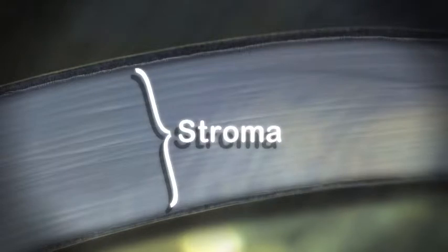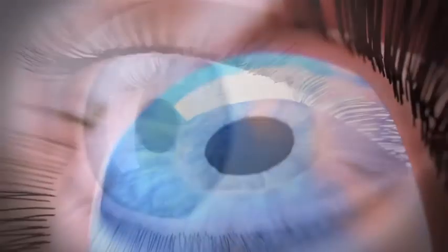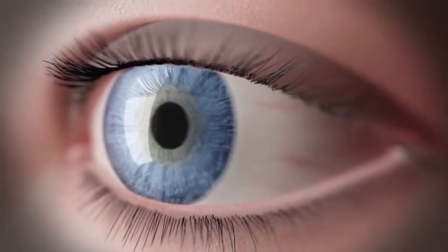This next layer of cornea is called stroma, and stromal tissue is not regenerative. It does not grow back. So the changes that are made to this layer are permanent changes. That is how we go about permanently correcting your vision. There are a couple different ways we can go about making that flap.